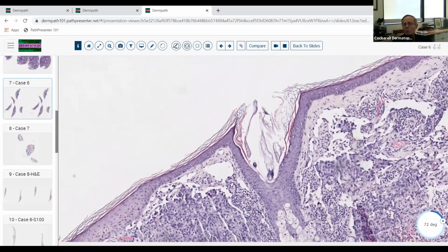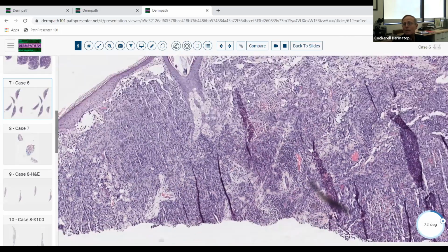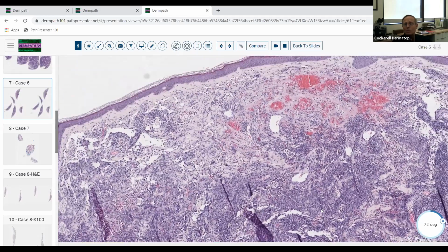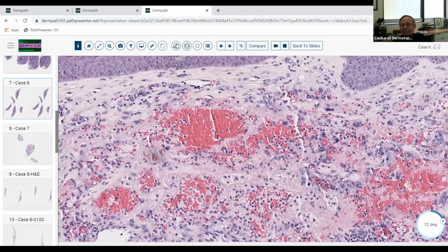So this is a situation where you're dealing with a soft tissue neoplasm that simulated something else for the dermatologist, and they really weren't thinking of an angiosarcoma. You just look at this area right over here, and this looks almost just like a garden variety angioma. Very, very subtle. So be careful of shave biopsies when you're dealing with a soft tissue neoplasm.